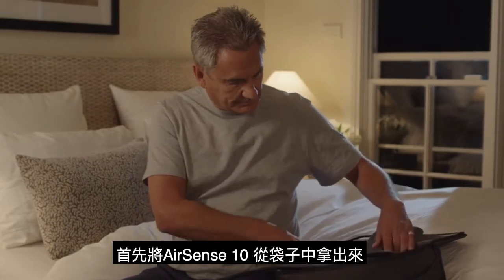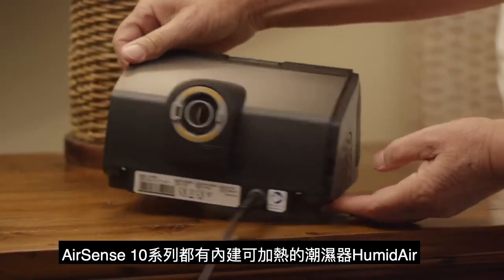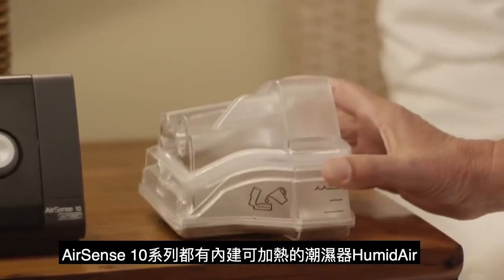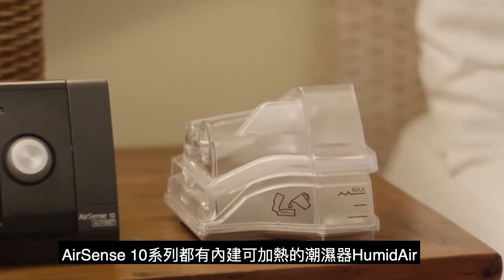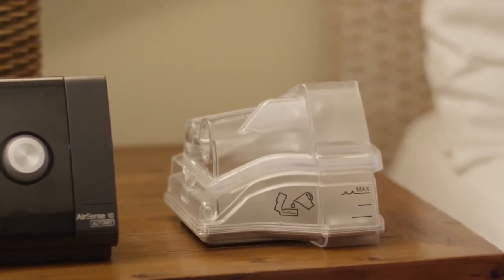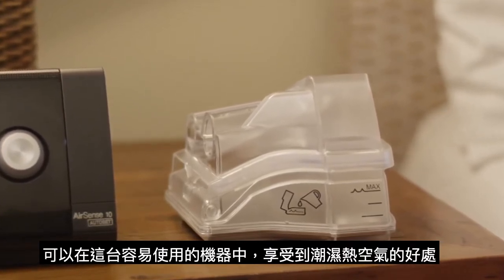First, take the device out of its bag. Connect the power supply and plug it in. The HumidAir Heated Humidifier is built into all AirSense 10 and AirCurve 10 therapy devices, so you can enjoy the benefits of humidification in one easy-to-use system.